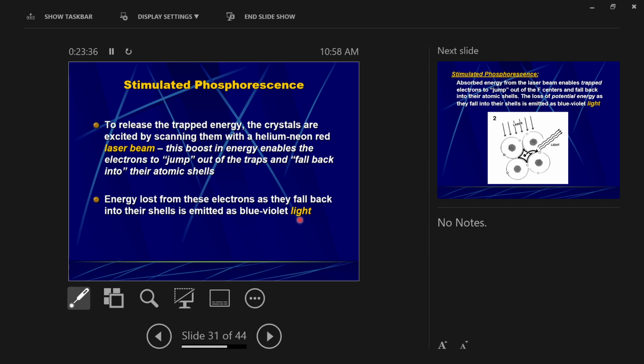But the point is, those phosphor plates store energy in the form of trapped electrons. When the electrons are allowed to jump back into their atoms, they have to lower the energy that they are hanging on to, so they do that by emitting visible light. And again, they emit as much visible light as they absorb in X-ray photon energy.